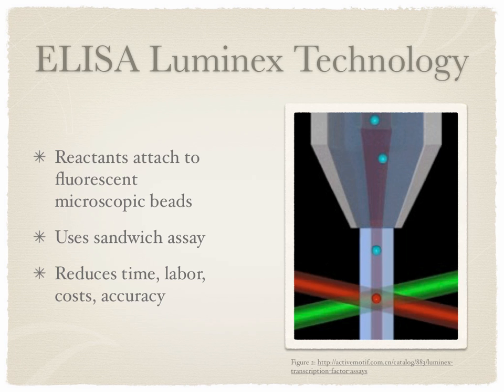It is popular to use due to decreased time spent on a test. Multiple tests can run simultaneously, and the costs are also lowered using the ELISA Luminex technology. To run tests with this technology, it is less expensive due to the use of less reagent, smaller sample requirements, and less paid labor. The Luminex technology is also very accurate.